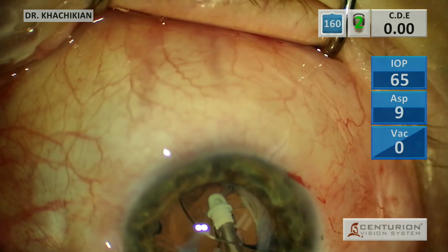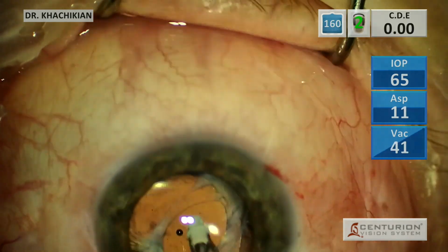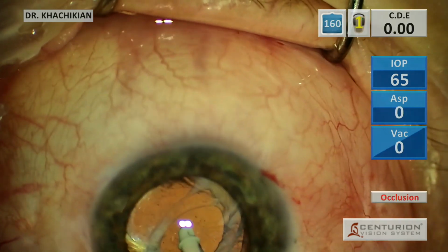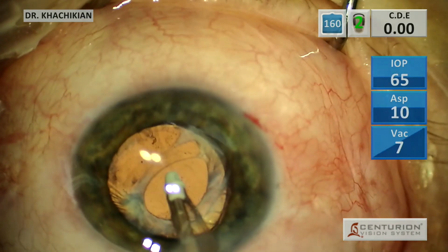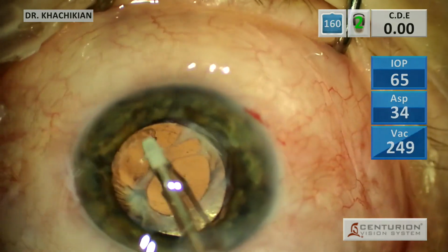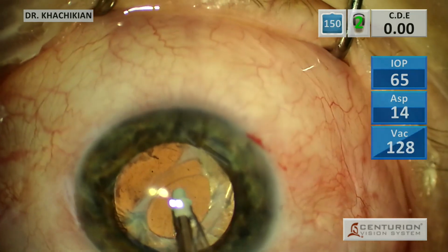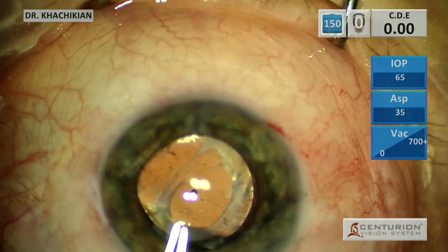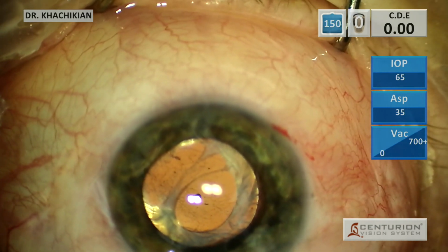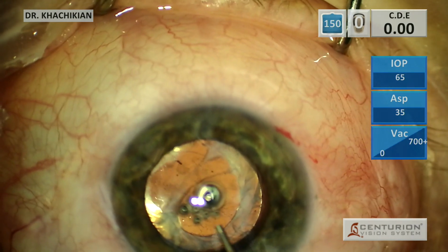It's going to take a beating, really, as you move that lens around. You want to be gentle, but it's not going to be like a fresh capsule that may be more fragile. There's going to be some fibrosis here. You want to obviously be careful of the zonules to not dehisce any zonules in any areas.